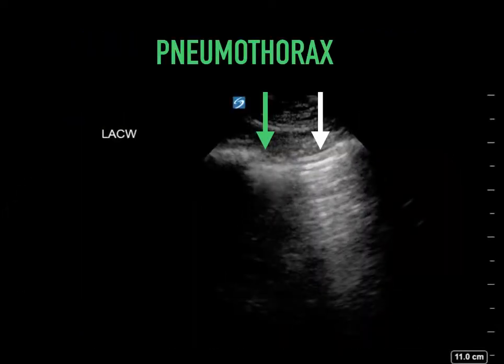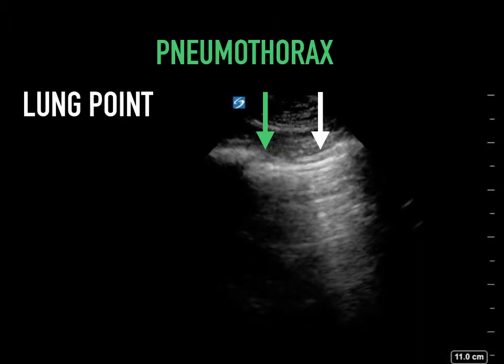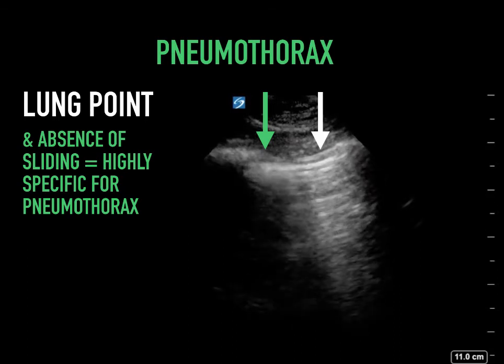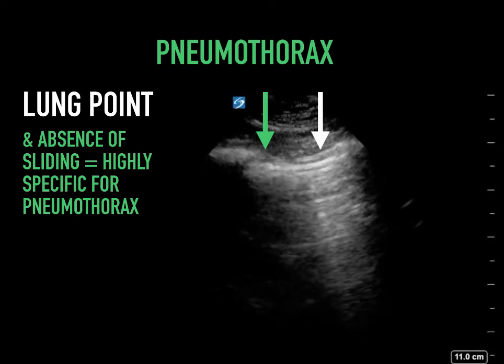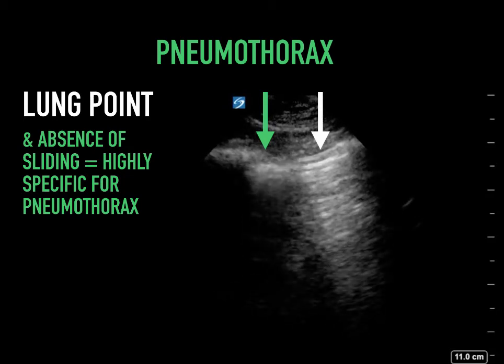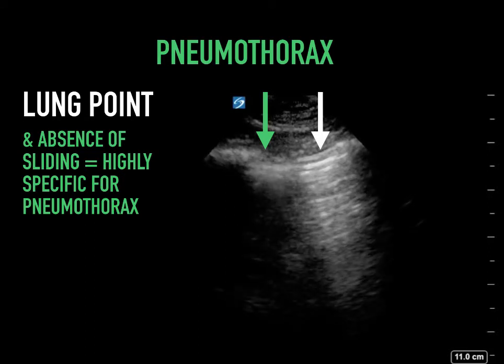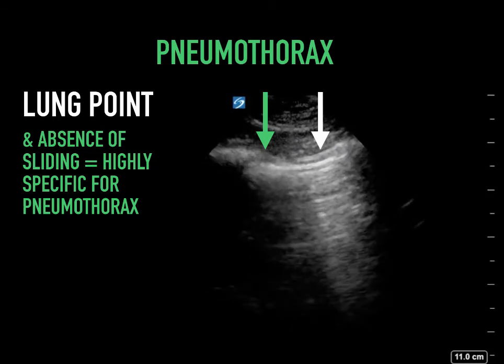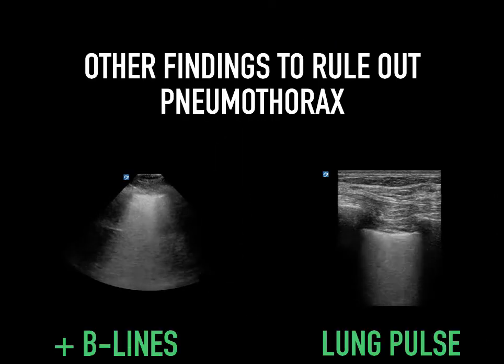This finding is particularly important — it's called a lung point. It demarcates an area between sliding (the green arrow) and no sliding (the white arrow). This is the exact point at which we see loss of pleural apposition — the transition point between no air between the pleura and air. This is highly specific for pneumothorax. Other findings to help rule out pneumothorax include B lines and lung pulse, where lung pulse reflects cardiac oscillations transmitted to the abutting pleura.